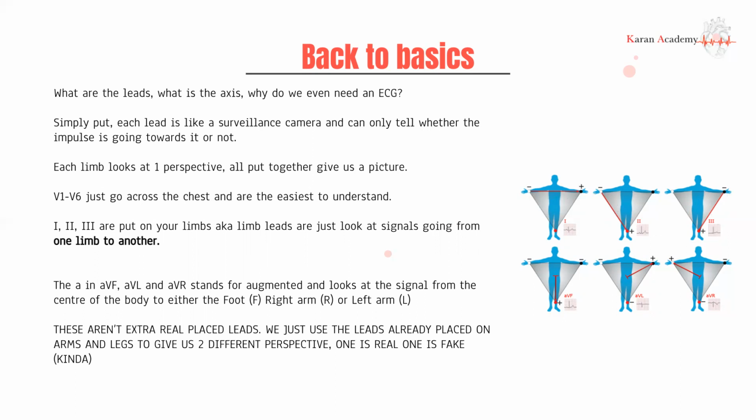Next, we have these weirder leads that are called AVF, AVL, AVR. Now, what do these stand for? So the A stands for augmented. Why are they called augmented leads? Well, because we aren't adding an extra lead to your belly button, we basically are able to generate these hypothetical or predict what this direction would look like. And that's why it's called an augmented lead, but it still has a lot of purpose, and we'll go through what that is. The F stands for foot, the L stands for left arm, the R stands for right arm.